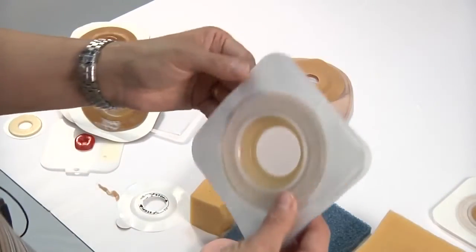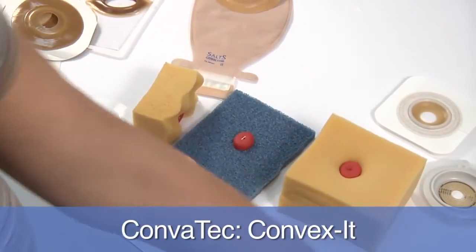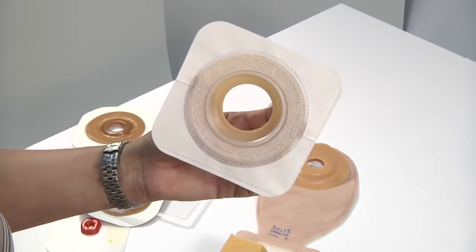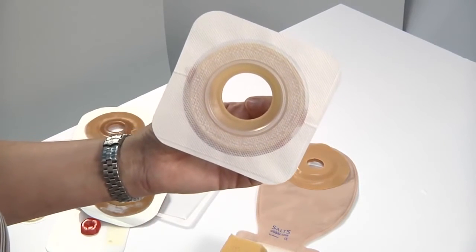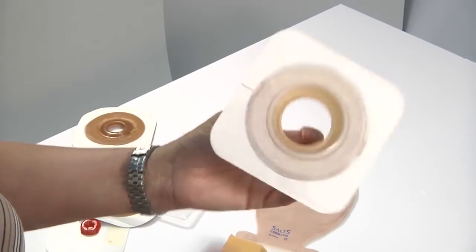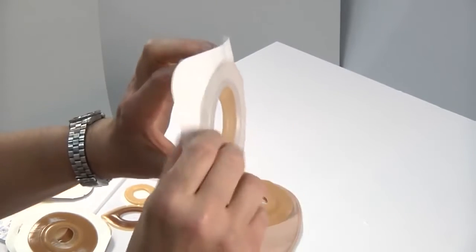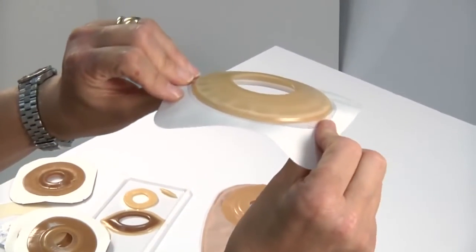Convatec has two options as well, and again, this is their integrated, where it's actually built in. All of the integrated convexities, when they're built like this, actually have varying sizes based on your needs. So if you look at the product catalogs from the companies, I think the smallest one that they start off with is about 1/2 inch in diameter, and the largest one is 2 inches in diameter. This happens to be a 1.5 inch opening. But again, you can see what the rigidity is. This is very, very stiff, and you would not be easily able to distort that when you're putting it over somebody's belly. And this one's got a fair amount of depth to it.